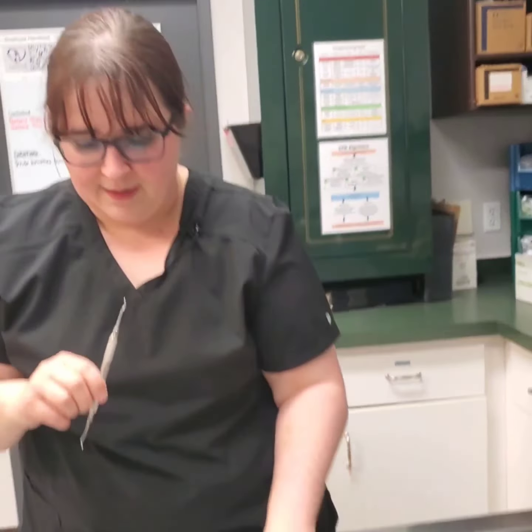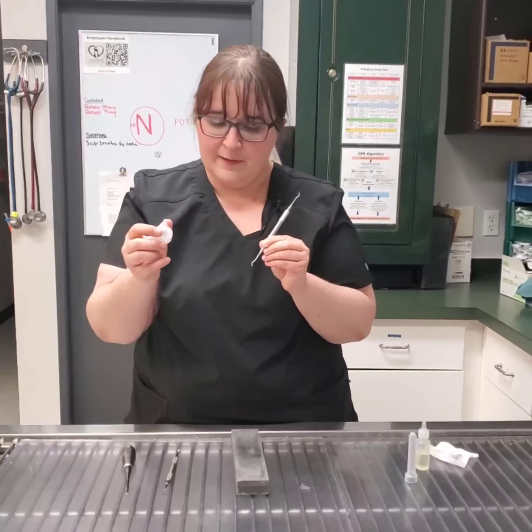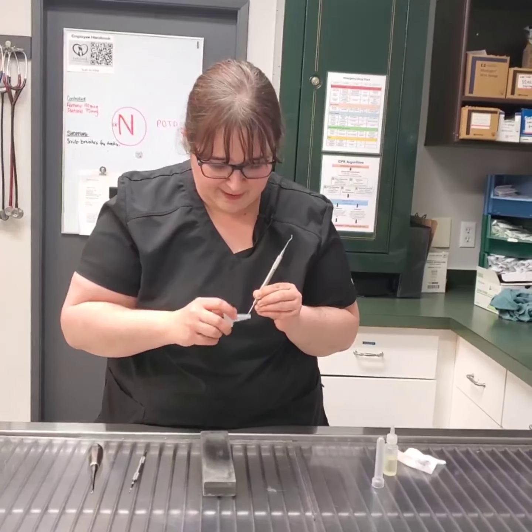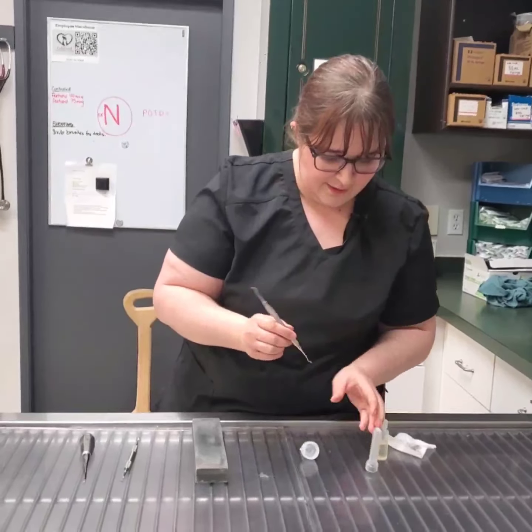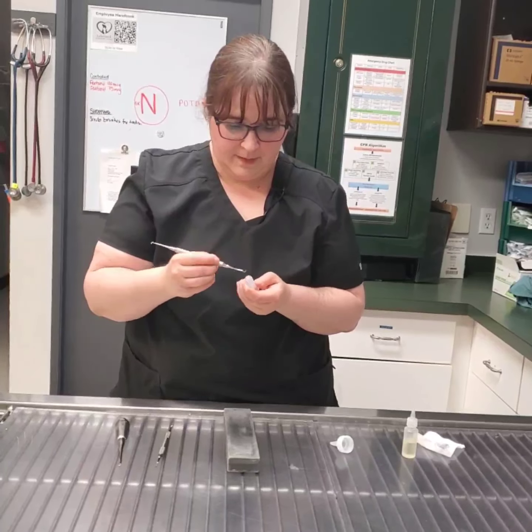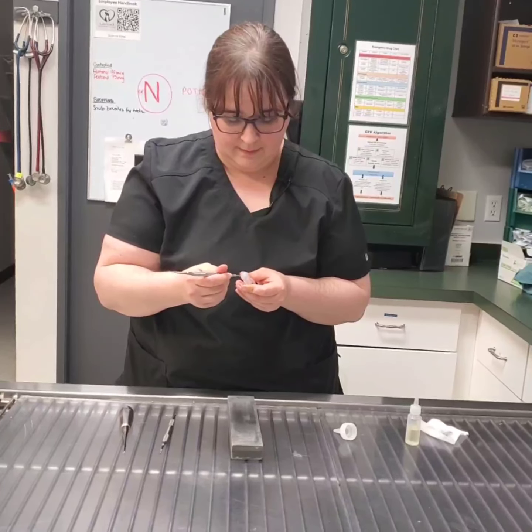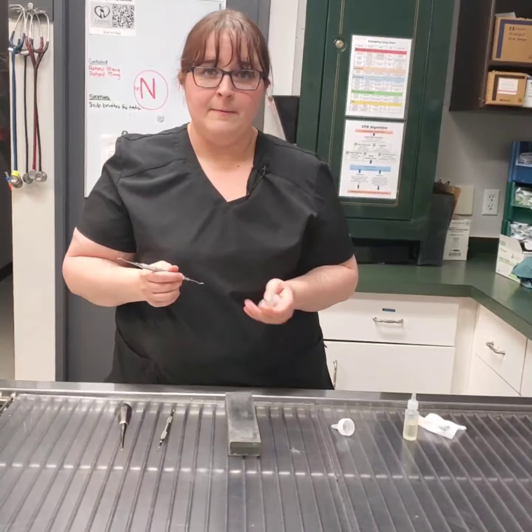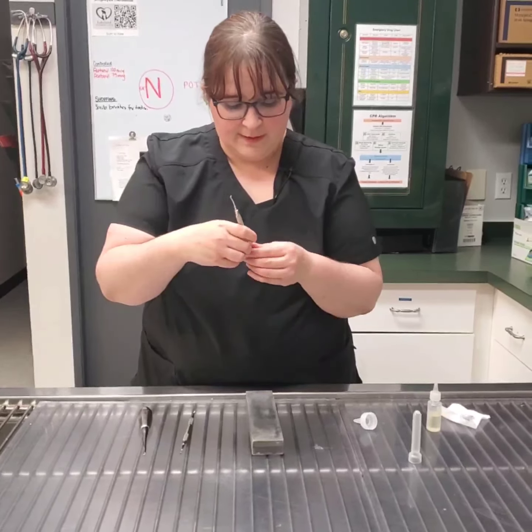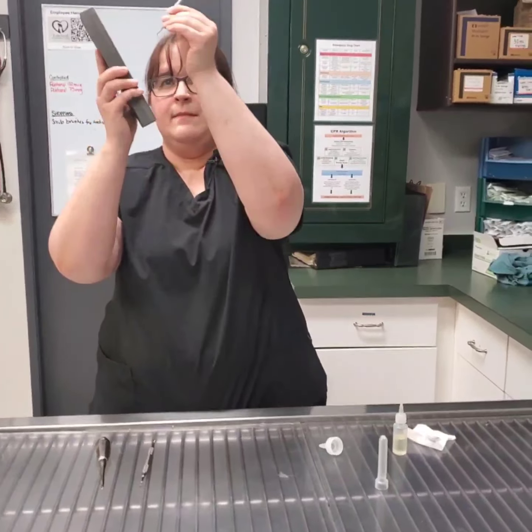There we go. And at this point, I would take my conical stone, and I would use this to get rid of any burrs that we may have. And I can test the sharpness by going here. And it should catch. So it's sharper than it was. It's not fully sharp, so I'm just going to do that again.